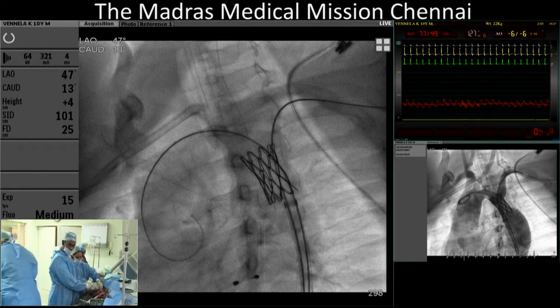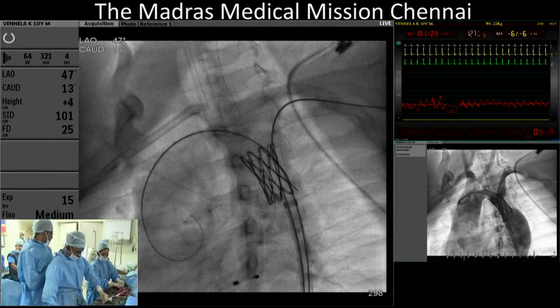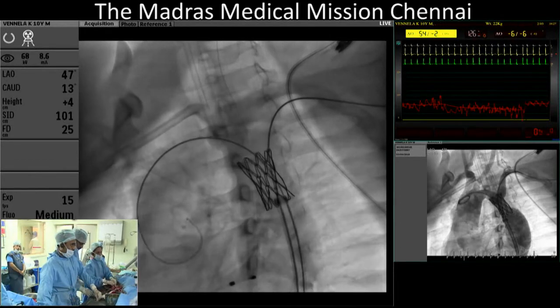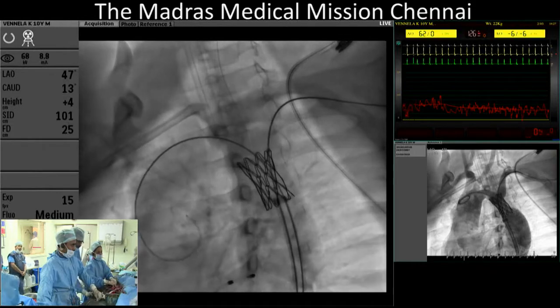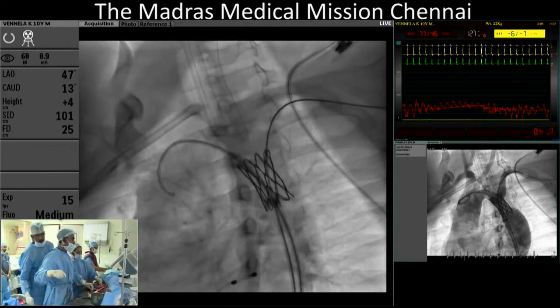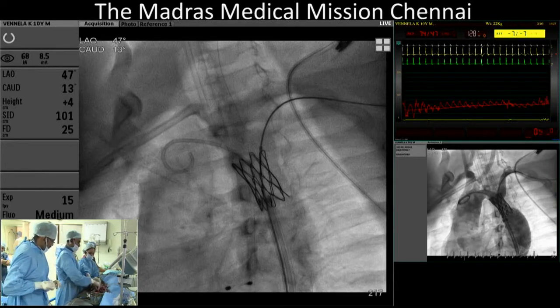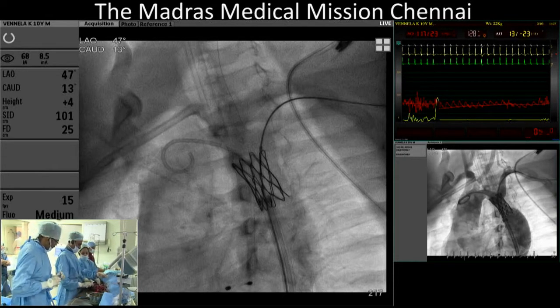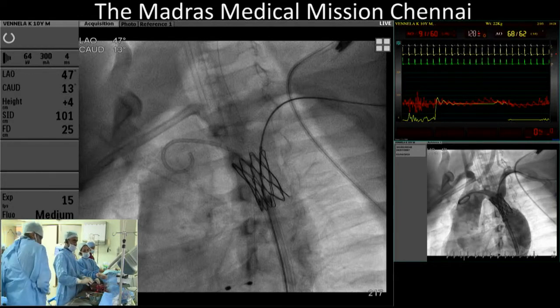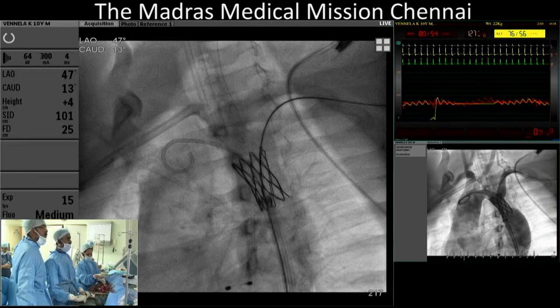We have another question from Mohammed. Go ahead. Just to continue with the Nick comment. I had two patients, one was 16 years old and one was 17 years old. Exactly the photocopies of this patient. Transverse arch was small and hypoplastic. We stented, and there was severe hypertension in both. One patient went to Harley Street where they repaired the transverse arch, and they left the stent as it was. The stent was in a good position, and the hypertension resolved. And the second patient had exactly similar pathology, which has a jump graft from ascending to descending aorta. I think this is a problem, transverse arch, and it will be in the future as well.